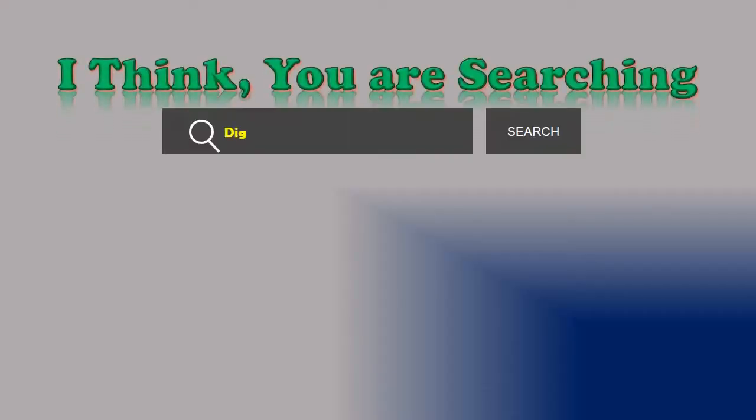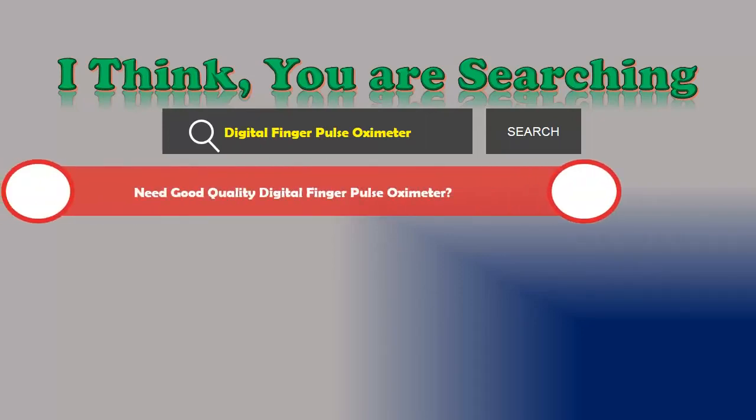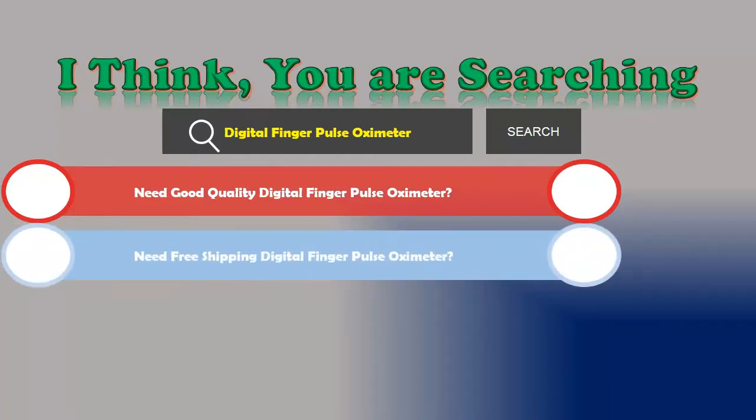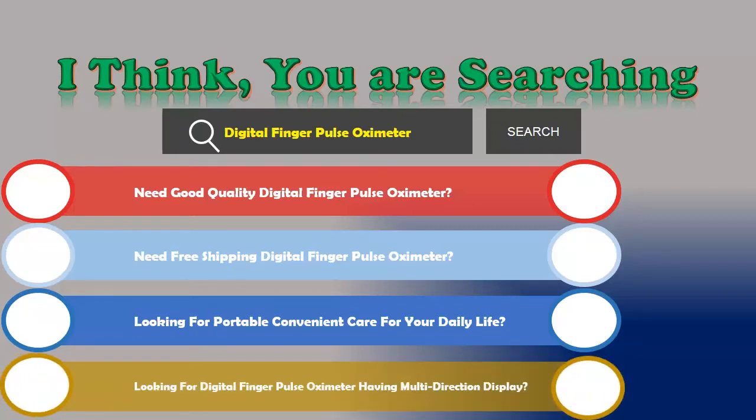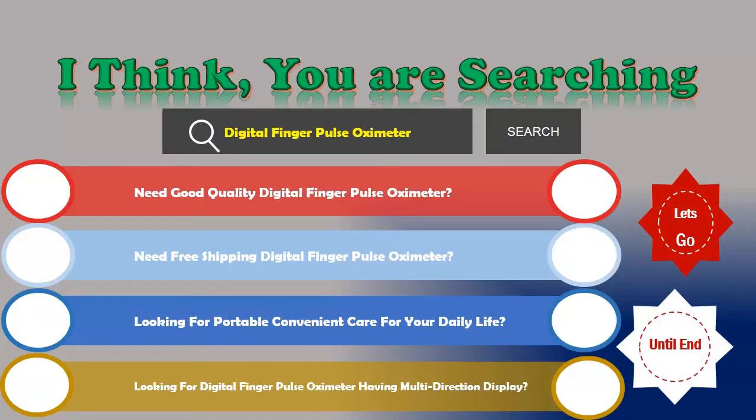Hi! I think you are searching for a digital finger pulse oximeter. Are you looking for a good quality digital finger pulse oximeter with free shipping? Looking for something portable and convenient for your daily life, with a multi-direction display? If the answer is yes, then stay with us — we are reviewing the top three best digital finger pulse oximeters.